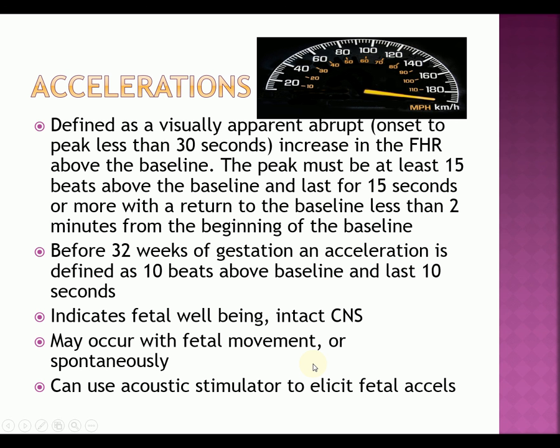So an acceleration, you see I've got the little gas speedometer up there. It really speeds up. A definition of the acceleration is a visually apparent abrupt increase in the fetal heart rate above the baseline, where the onset to the peak is less than 30 seconds.